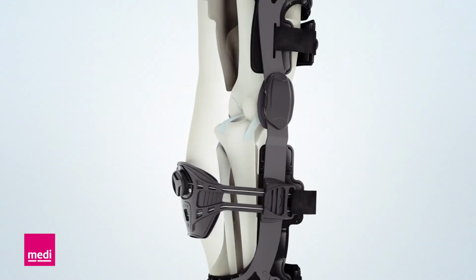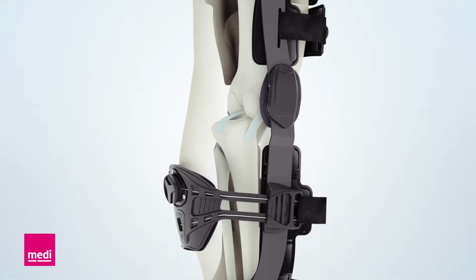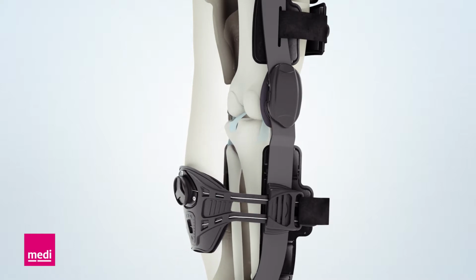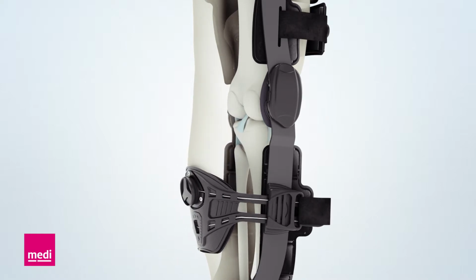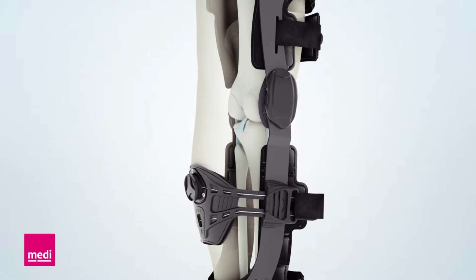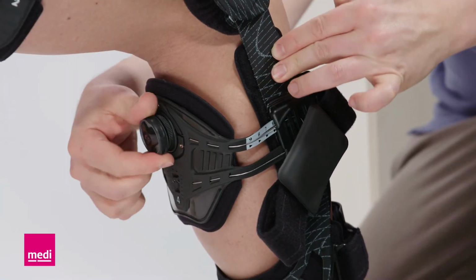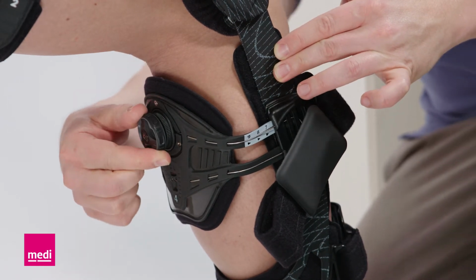The most typical sign of injury to the posterior cruciate ligament is the posterior drawer effect. This can be counteracted through active application of force to the support pad. The tibia will be brought into the correct physiological position and held there securely. Therefore, turn the wheel until the tibia has been securely stabilized.